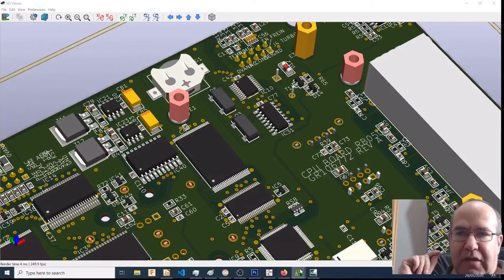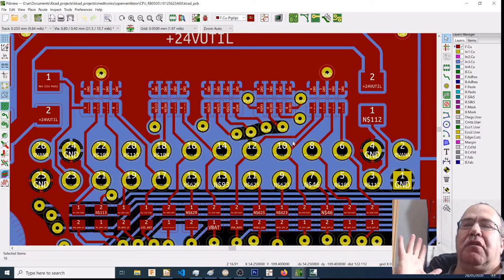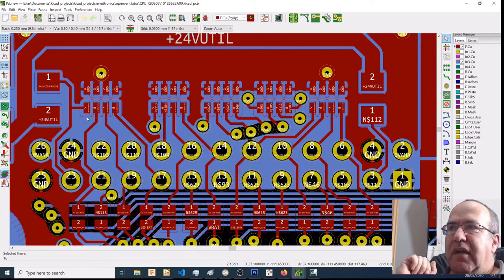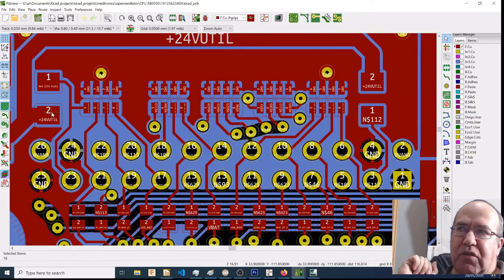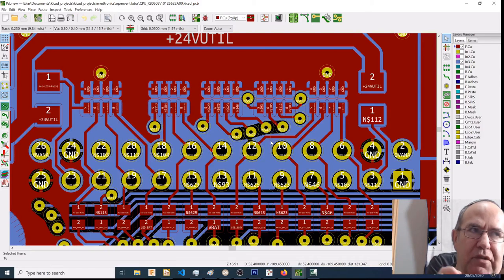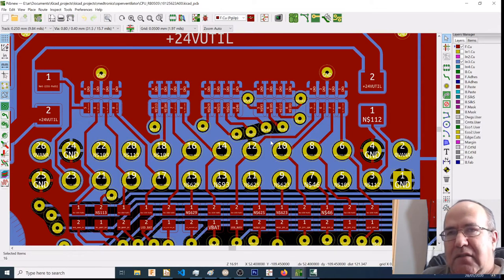Okay, I'm going to go back to my 2D view. And one can see 24 volt util. It's the opposite end of the board to the O2 valve. And if you're not forced to do this, I don't think it should be done.